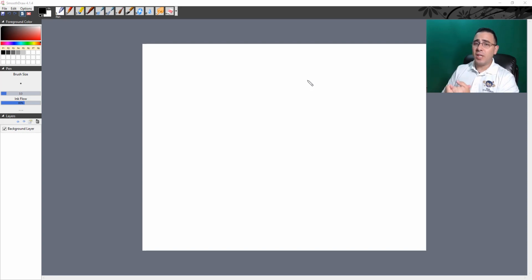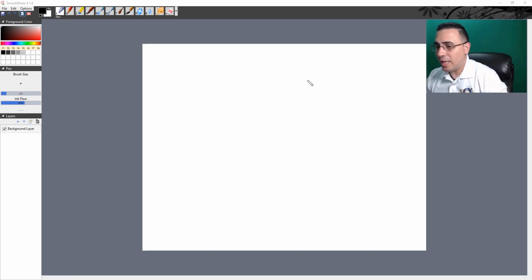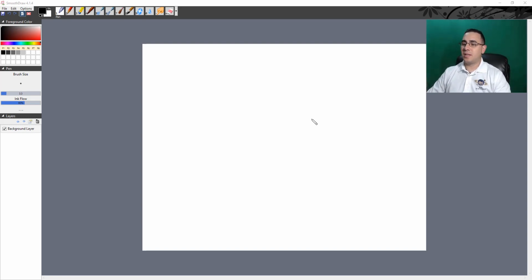Well, aliasing is an artifact. An artifact is something that shows up in the image which is not real. And as I said before, we have some good artifacts, we have some bad artifacts. Aliasing is a bad artifact because it doesn't give you the proper information for the peak systolic velocity, but it's not bad at all because it tells you that you have an area of high velocity. And that's very useful when you're looking for stenosis. So aliasing, let's go into this and let me show you the way it looks.